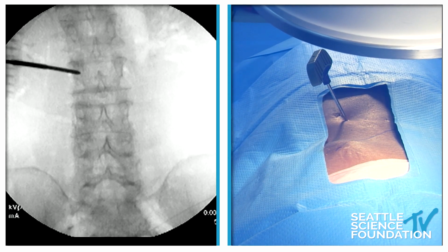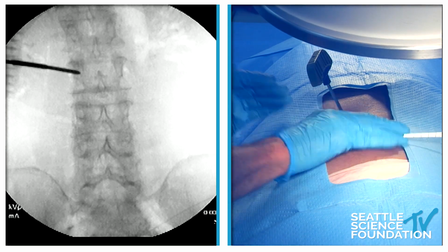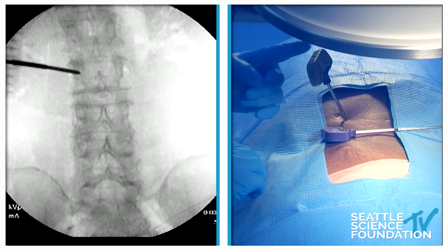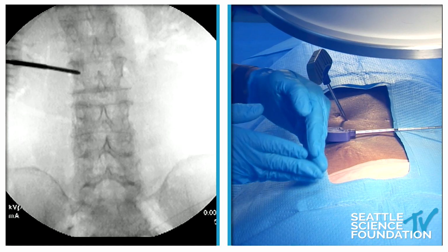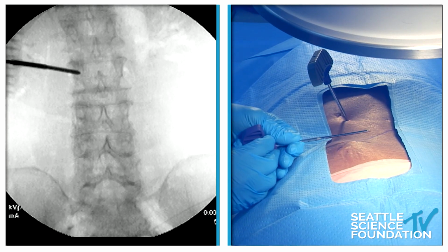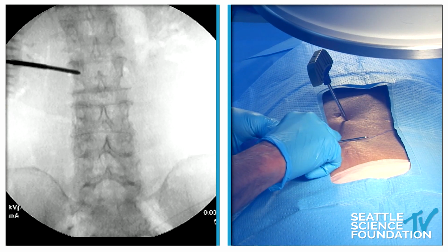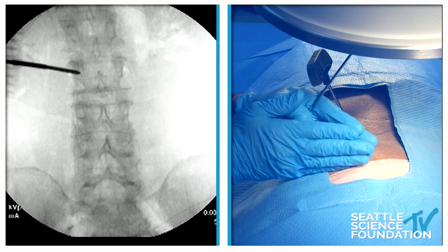I'm using the needle technique with the bevel. It's a single bevel, so this has directional capability. The arrow is pointing this direction. It's beveled like this, and it tends to steer away from the face of the bevel. This is a bi-beveled needle, with a bevel on both sides, on the top and the bottom, so it tends to steer like this.